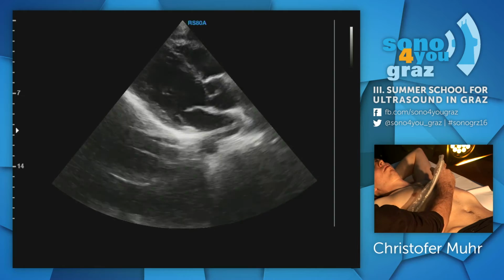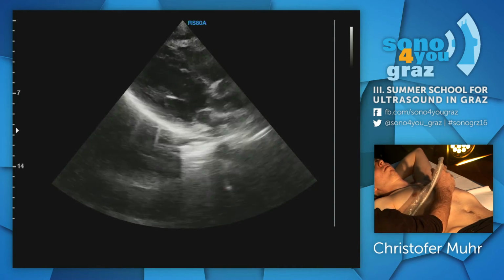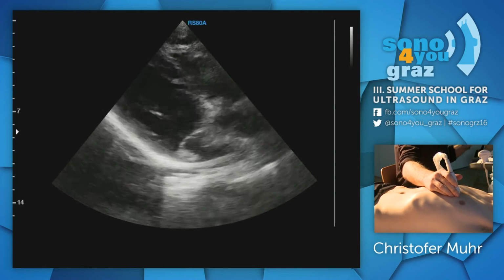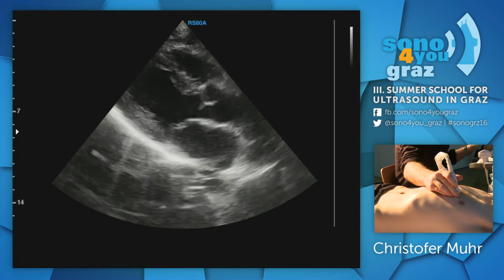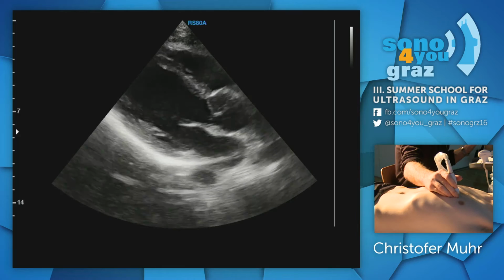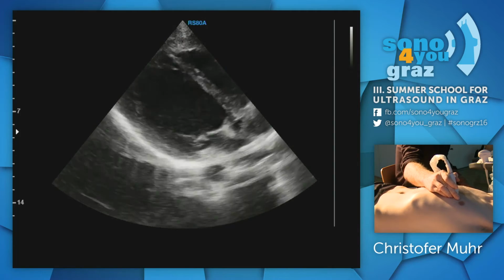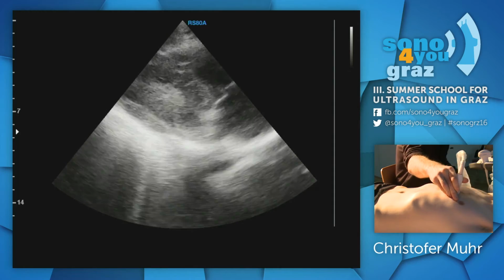For the parasternal long axis, try to be as close to the sternum as possible, okay? And press a bit hard because it is possible to sort of expand the intercostal space just a little bit more. So once we've found something that's pumping nicely, then same thing, we make small adjustments with the hand and see what happens if we turn it too much, but I'm only doing one movement at a time, no tilting and turning at the same time.